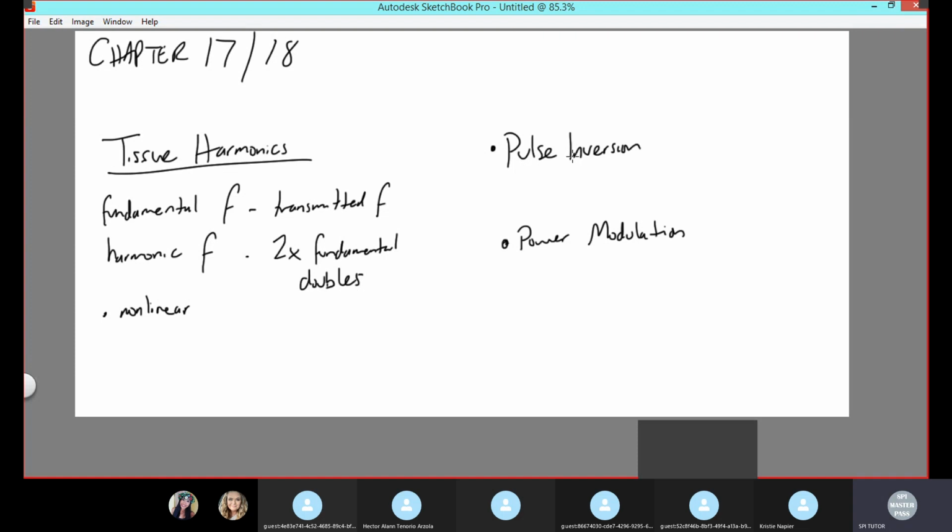I wouldn't say so, but I wouldn't be surprised if they ask you about these terms. Harmonics is a small part of the exam, so if you're asked about this, theoretically it should be about 1 or 2 questions. Theoretically. So you have pulse inversion and power modulation.